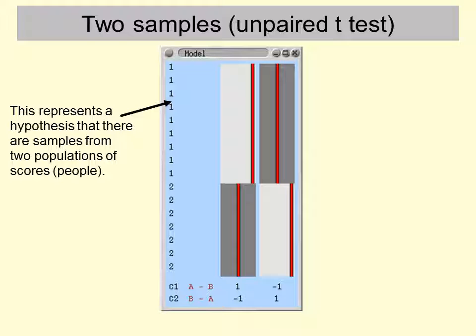It could be that group 1 are elderly and group 2 are not, or it could be that groups 1 and 2 are in fact from the same population of young people, but then they experience something a bit different in the scanner. It could be that you just give slightly different versions of the task to groups 1 and 2, and that you couldn't do an experimental design where every participant experiences both tasks, because that would have compromised the psychological validity of the task.